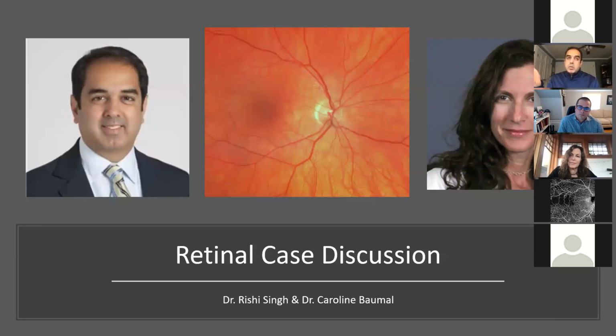And I think we're going to find, I'll predict a year from now, maybe we have a way of looking at that and saying, okay, 100 microns of fluid means that you really should have cut your interval down and treat and extend. We're looking at this in a very different fashion right now, where we're looking at IRF and SRF components, yet we don't have any really good way of measuring that. Maybe CST variability is a much better way of doing that altogether.